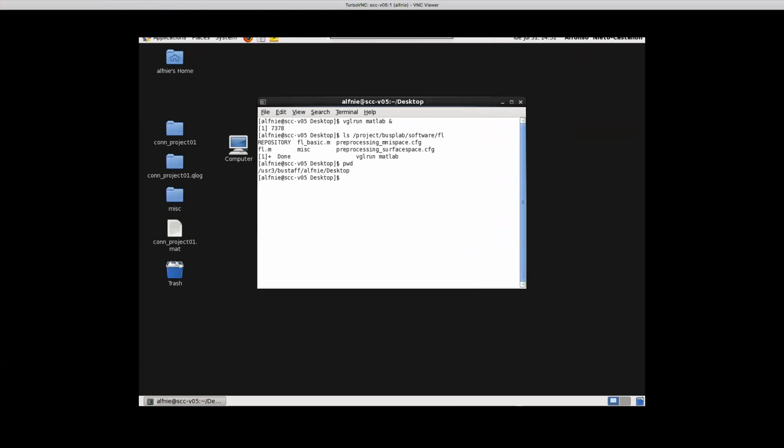So this resampling happens prior to the smoothing and prior to the first level analysis. I'm wondering, would it make more sense to do this interpolation as part of the second level analysis step?